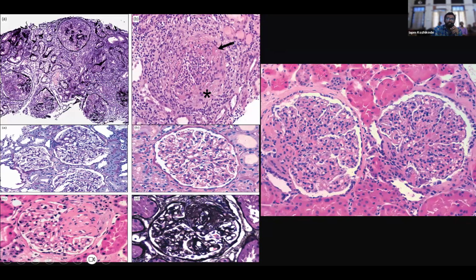So you can have various kinds of this pattern in the same disease, due to various factors. In the end of any renal disease, that segment of the glomerulus, if it is useless, becomes chronic inflammation, that is, sclerosed. It gets sclerosed, which means you will get FSGS, that is secondary, secondary to something primary like IgA or an MPGN pattern, whatever. And you can even get an MPGN pattern. Okay, let us go forward.